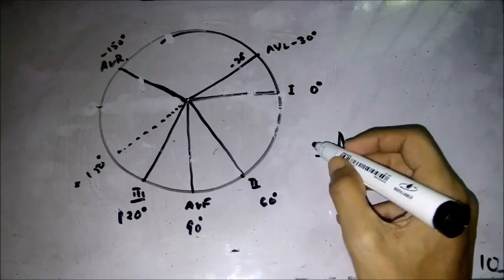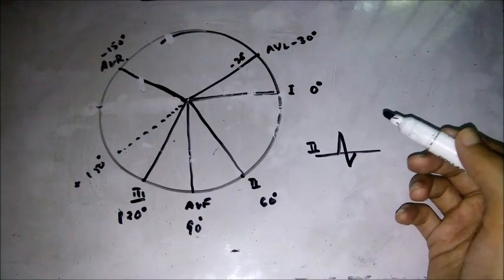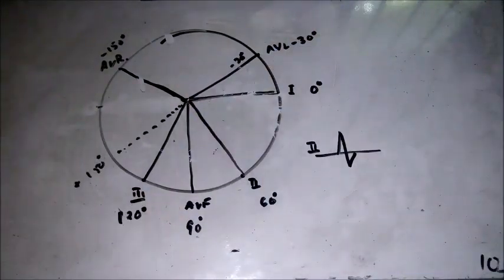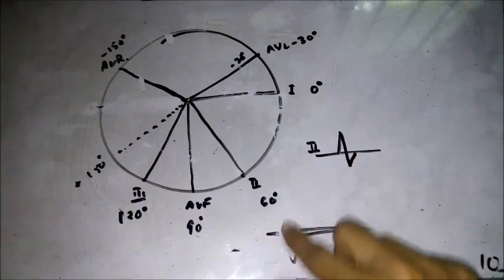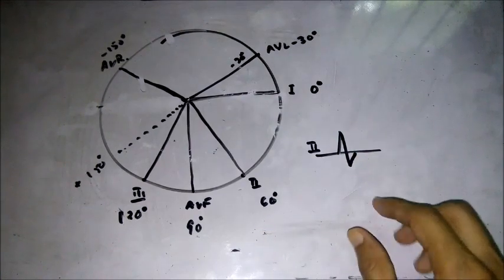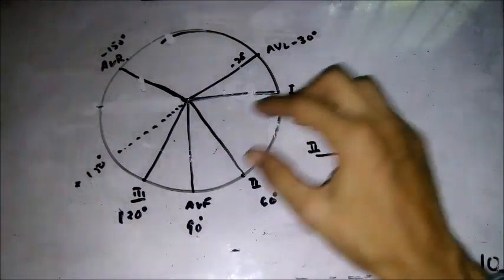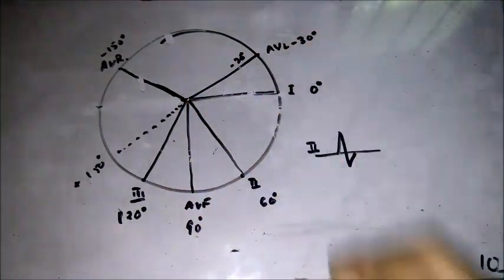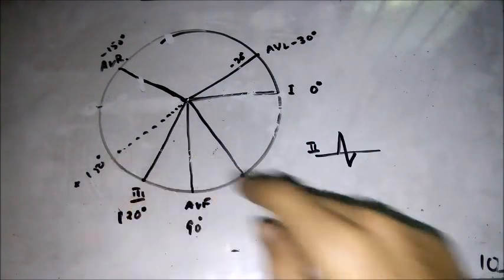And for example, if this is lead 2 and it's not completely isoelectric, what we can say is that the axis is towards 90. Yeah, so if it's more positive, then it's not completely at a 90-degree angle, so it might be at 80 degrees to lead 2. So this might be at minus 20, right? Or on the other side, something like 140, right?